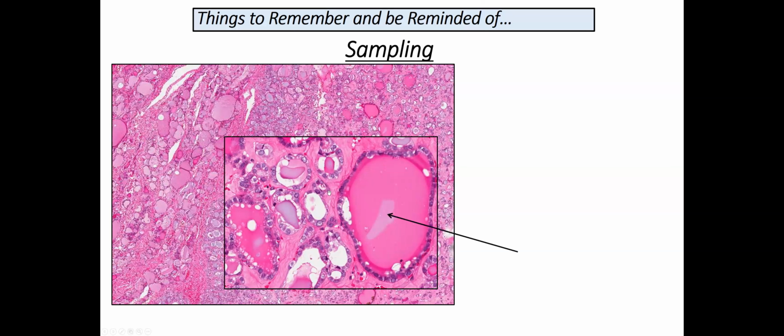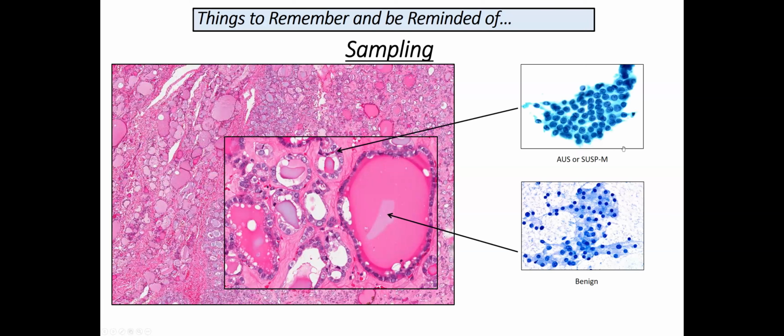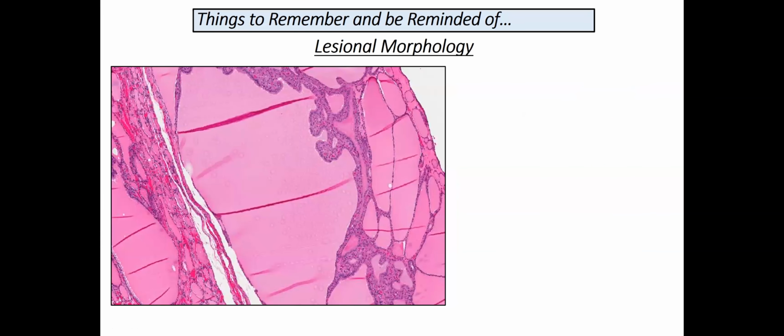which really have these prominent features of PTC. Now, where the needle goes, you may have two different cell groups. So I always ask the radiologist when they're biopsying these nodules to really sample different areas within the thyroid nodule to get a representative sample. And I think that is very important.